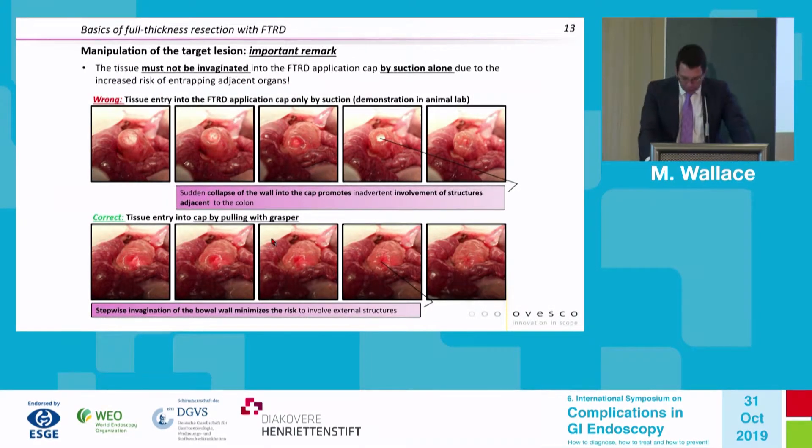These are ex vivo experiments provided by Ovesco showing why we avoid suction. This is a very large 23-millimeter diameter opening — if you suction, you can invert not only the bowel wall but also adjacent structures if there are adhesions. It is advised to avoid suction and only pull the tissue in with a grasper. Although in theory a dense adhesion could still be inverted, we believe mechanical traction only reduces the risk of entrapment of adjacent structures.